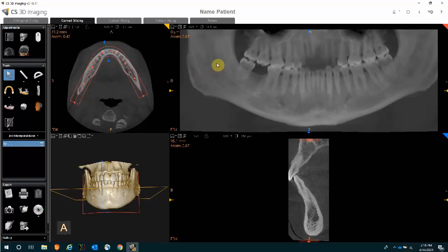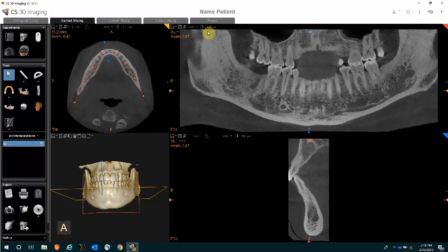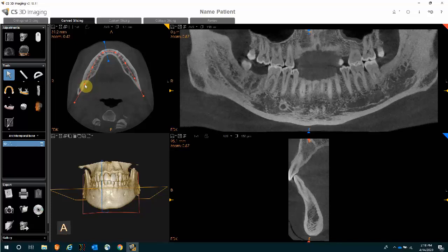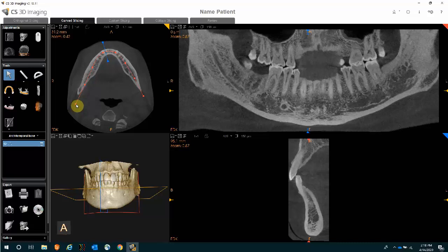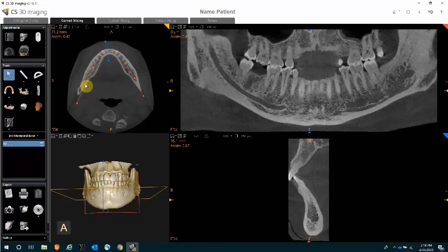At the same time, you will likely want to trace the mandibular nerve canal. To display it best and make it easier to find, go to your set integration and display the lowest number you see on your software. If you're looking to place an implant and trace the nerve on the patient's right-hand side, go over to the axial view and move the dot either lingual or buccal until you see the best representation of the nerve. If you move it in one direction and it's not there, click and hold and move in a different direction. Once the nerve is showing up, move to the next dot and do the same until the nerve is clearly displayed.